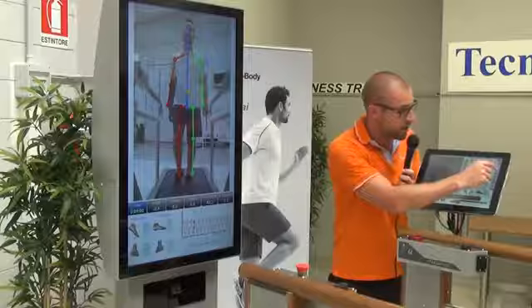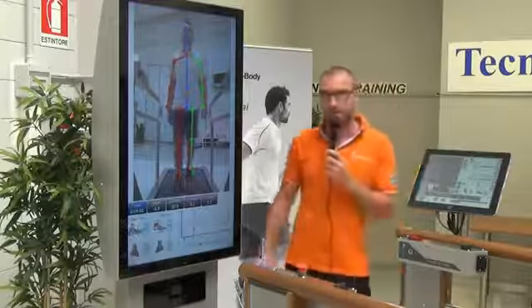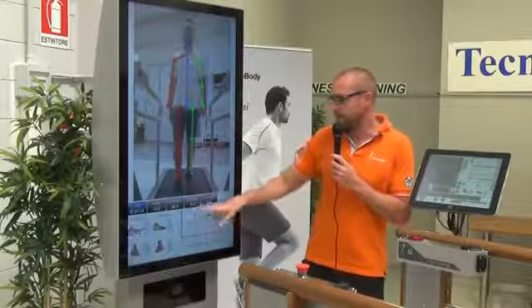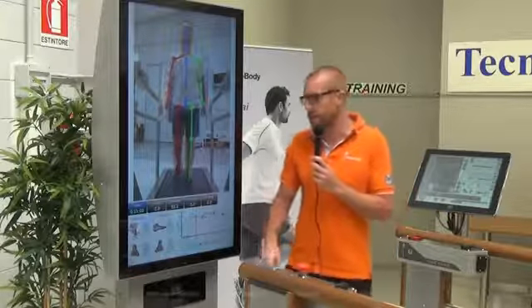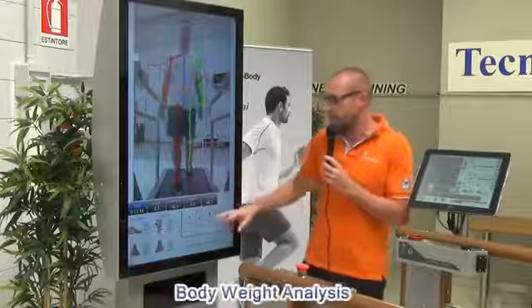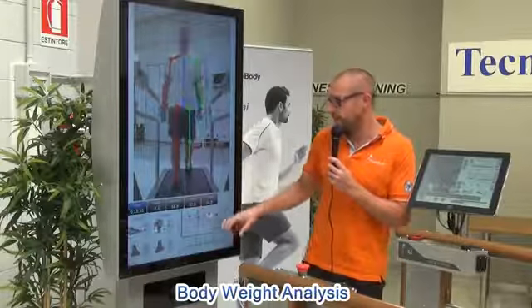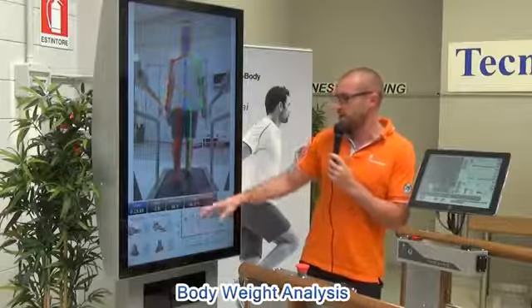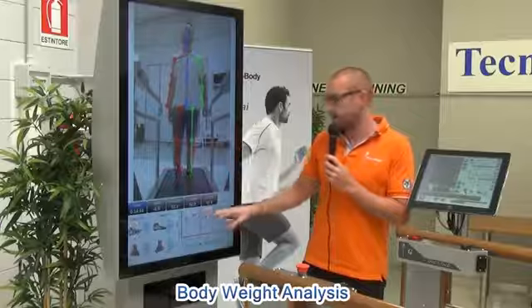For example, one very important graphic is represented by the load analysis. It means that I can see step by step what the load contact is during the walking. As you can see, you can divide and understand in an easy way the red and the green dots, which represent the red, the left side, and the green, the right side.